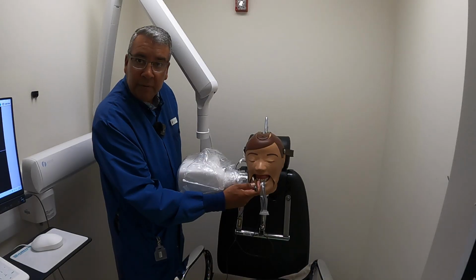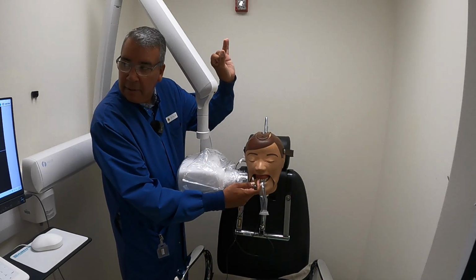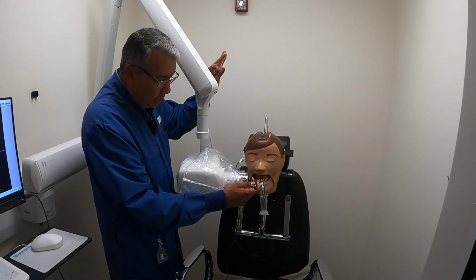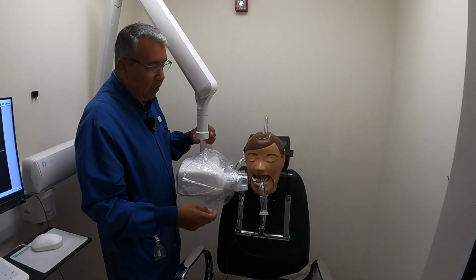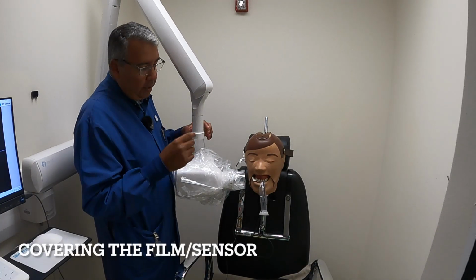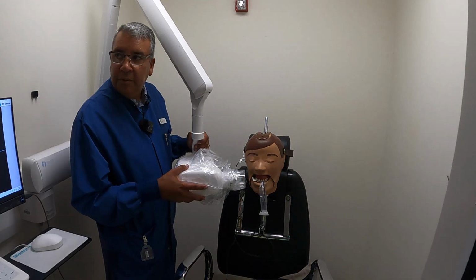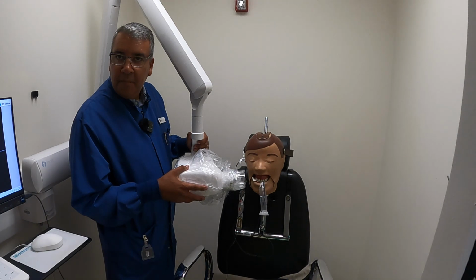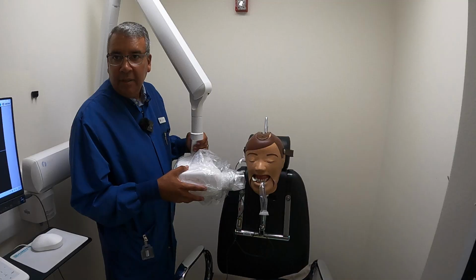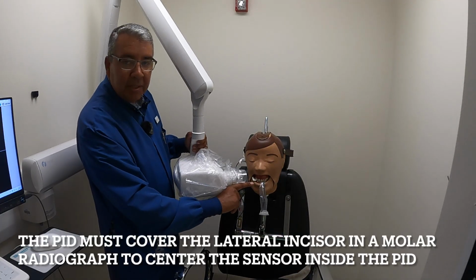The first one was the vertical. So we established the vertical, we established the horizontal. What's left? Cover the film. So how do we cover the sensor? The side of this has to pass or cover which tooth? The canine. We want to pass the canine, but we don't want to just cover it. The incisor. What incisor? The lateral incisor. This side of this must go to your lateral.